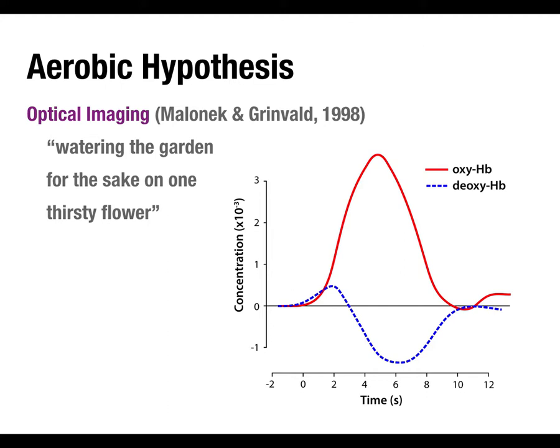And so that's where this BOLD signal comes from. Even though we expect an increase in oxygen consumption, we actually see a signal that tells us there's way more oxygen there than there was before. And it's because we're flooding that area with more oxygen than it needs. The reasons for this are physiology and evolution, and we can't really know.